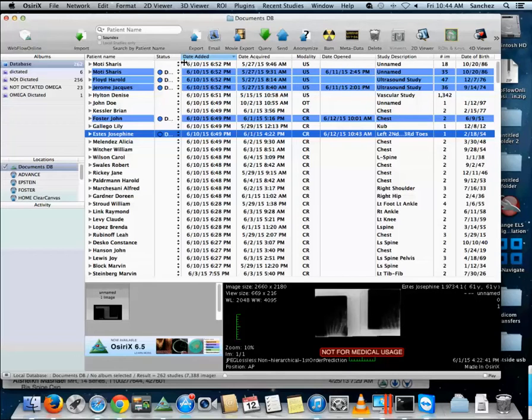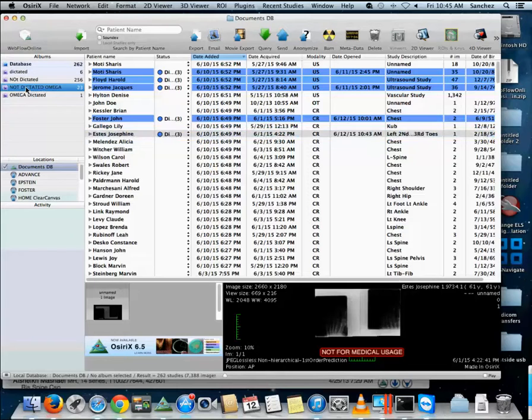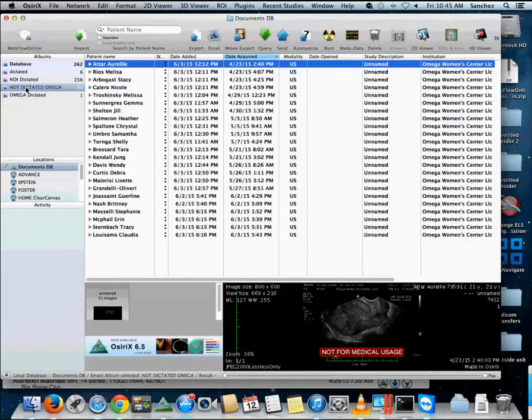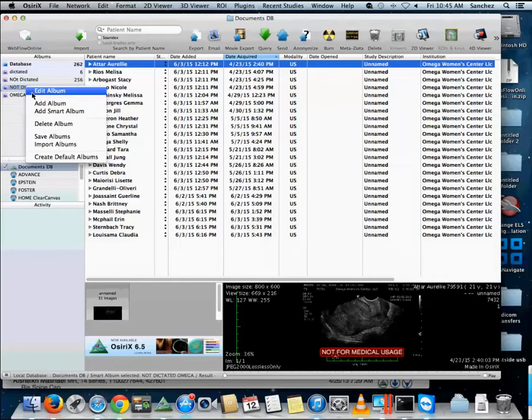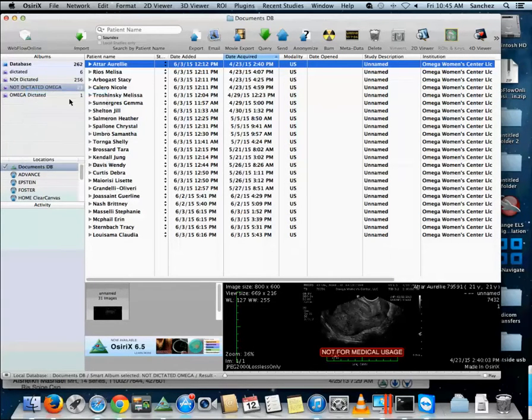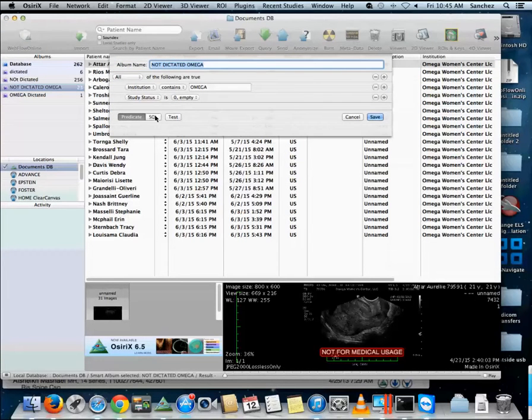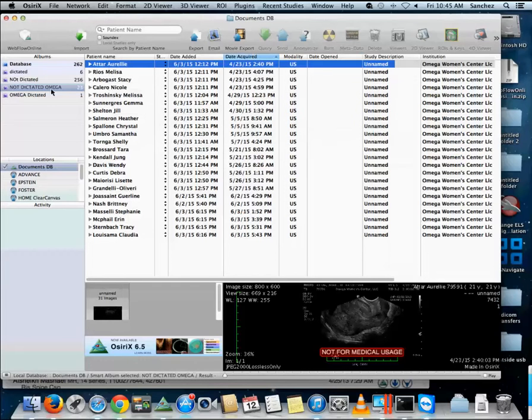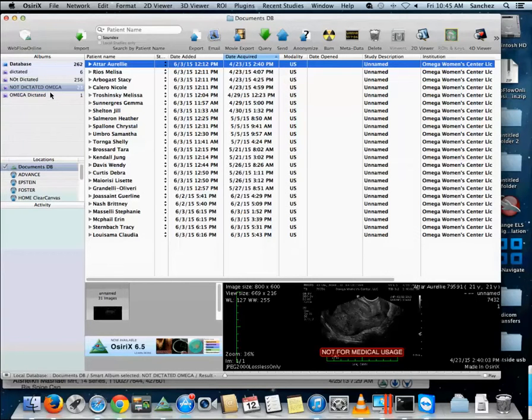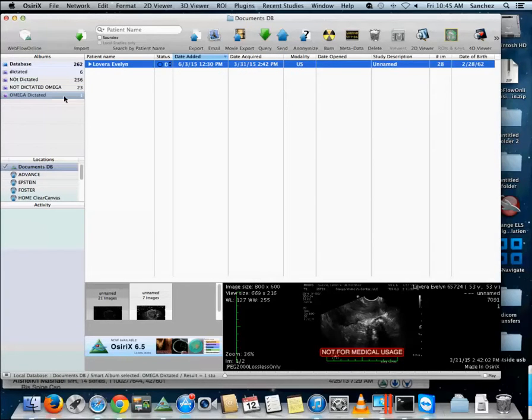Now we have created these smart albums. These smart albums are created using SQL queries. We can see here that this is the query that is being used. Click the SQL, this is the query and it is creating us a smart album. So what this is, is not dictated, meaning it doesn't have the blue circle with the client name of Omega. And this is dictated with Omega.